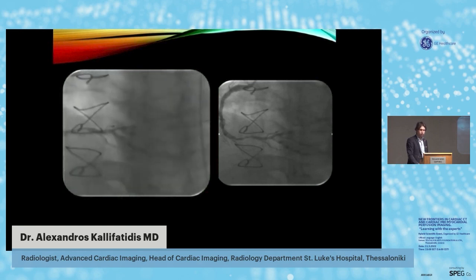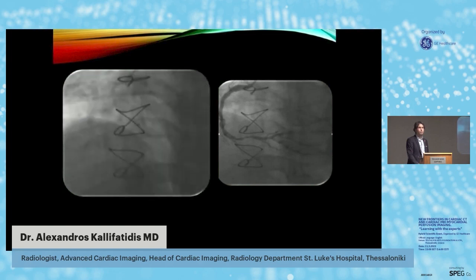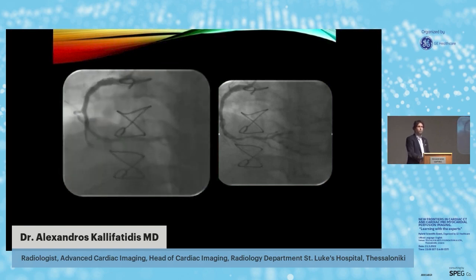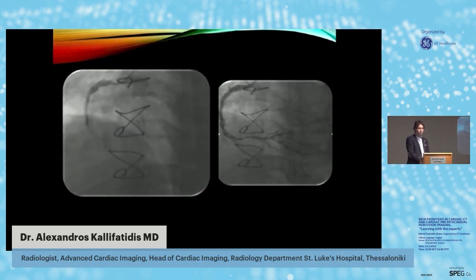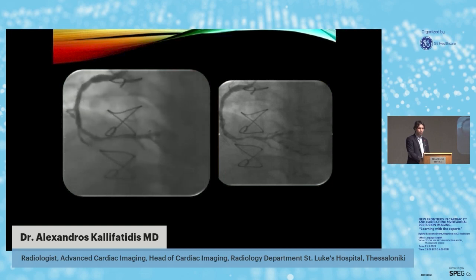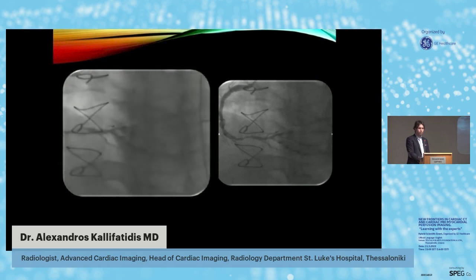Currently, we can perform the quantitative perfusion using the commercially available perfusion sequences, either the gradient echo or the SSFP. What we need today is a dual bolus approach. So we give an AIF bolus, we do the stress mapping, then we give the stress bolus, and then we do the same dual bolus approach for AIF and stress to acquire our rest images.